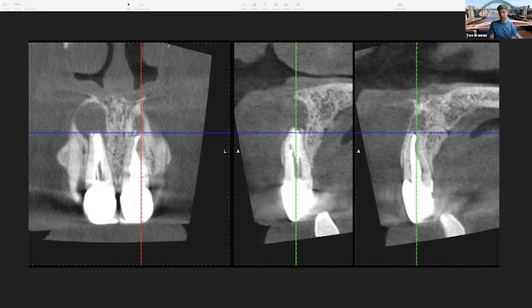But I think in this case, we've been able to show the patient a lot more and she's consented to the fact that we're going to attempt this by removing the crowns, which we can do anyway. So we'll retreat them orthograde, taking the posts out. But there's a chance that we might still need to do a surgical option, and that may affect how I'm going to obturate these teeth through the canal.